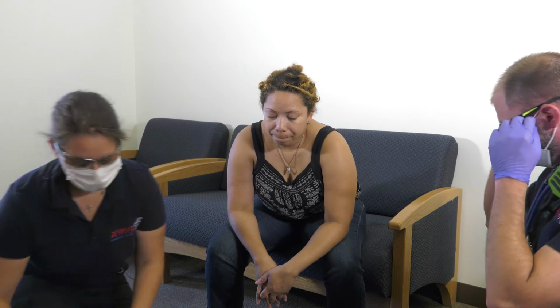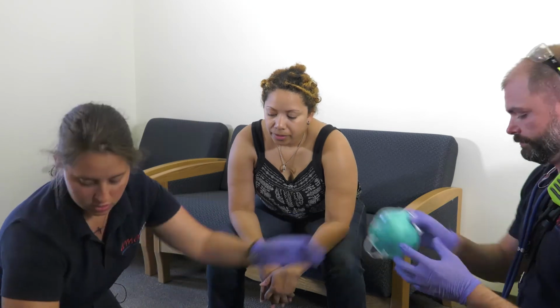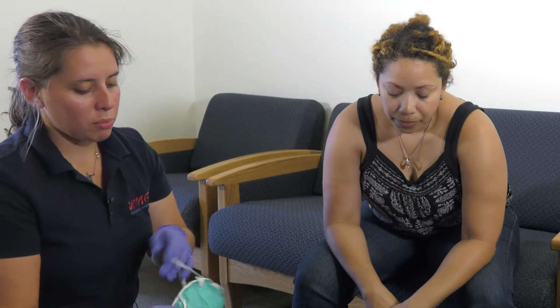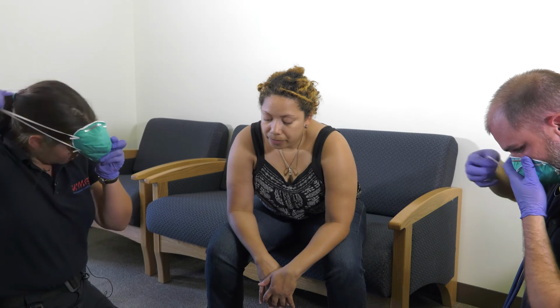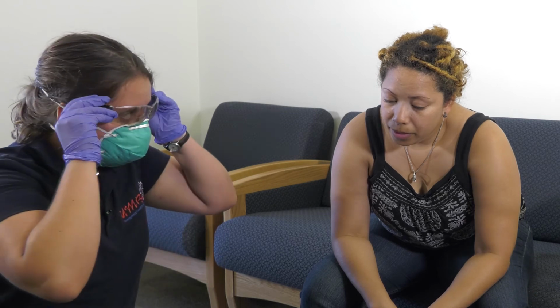All right, how about we give her a neb treatment and let's switch our mask to the N95. Sure. Okay. All right, ma'am, we're going to be giving you a neb treatment, and just because of the procedure, we're going to be switching our masks, okay? How long ago did you say this started? About 3 hours. 3 hours, okay.